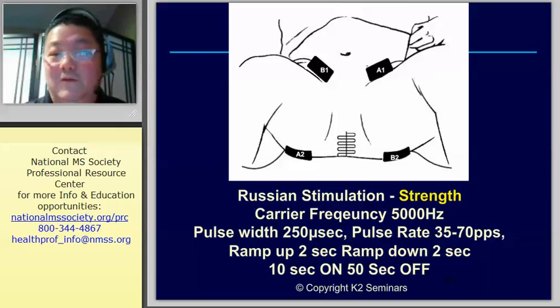I talked about pelvic floor, didn't I? Increasing pelvic floor strength you can accomplish with electrical stimulation. This is a crisscross format, so the A's represent one channel and the B's represent the second channel. In this case, you're going through the body to get the pelvic floor to increase in strength. Why is this important? You're going to be able to control the sphincter. If you can control the sphincter, you can control incontinence. So you can control how the bladder fires. They have a lot of problems associated with incontinence. Here is a way to do it.